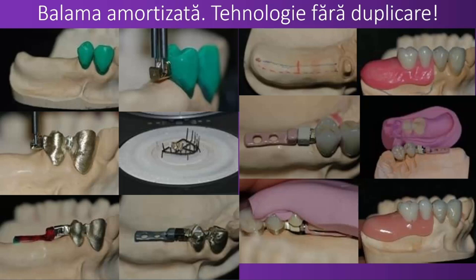So once you have modeled over this whole device, after you model the acrylic teeth or composite, or pink wax, whatever, then, as you see, we make an index of it, a silicone index. The teeth stay there, the wax is washed away. This is what remains free. This is something white, like a covering that is applied, painted white, and that prevents the acrylic resin that we will place there from getting into the mechanism. And then you place everything into position, and all this is going to be filled with acrylic resin.